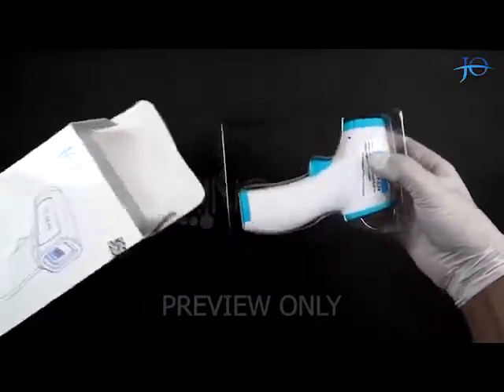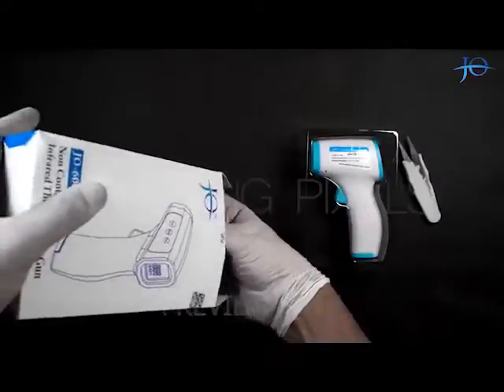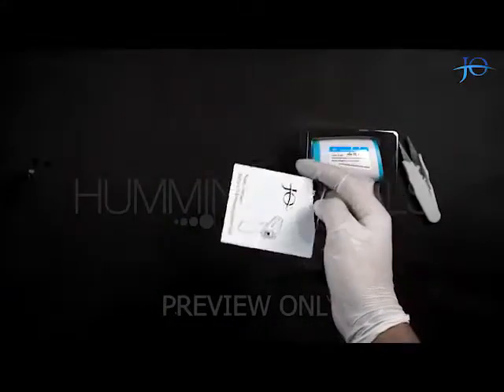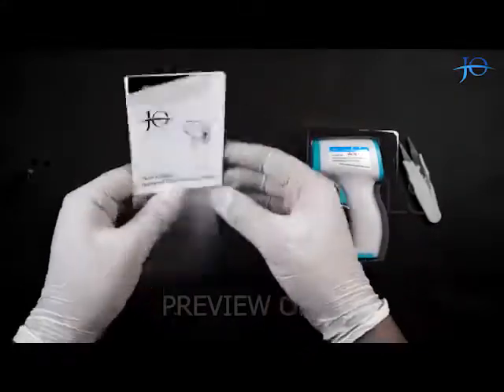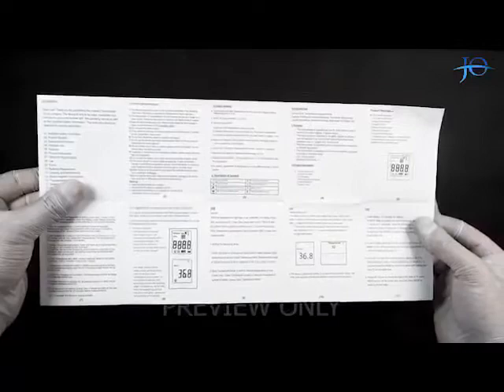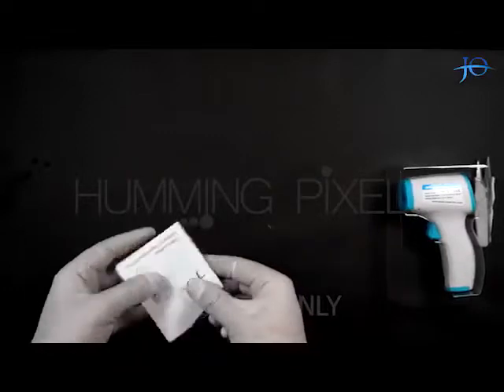It comes in dual colors — white and blue. The box also has a user manual in it, having all the instructions for usage and troubleshooting. Let's keep this aside and talk about the product.